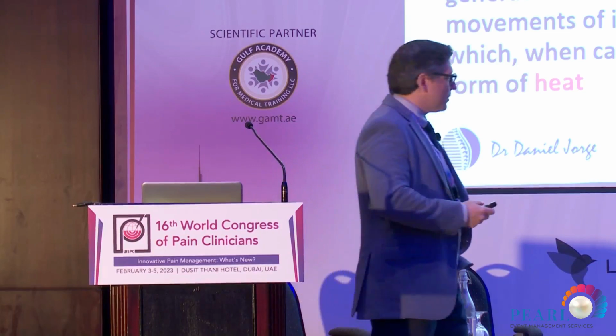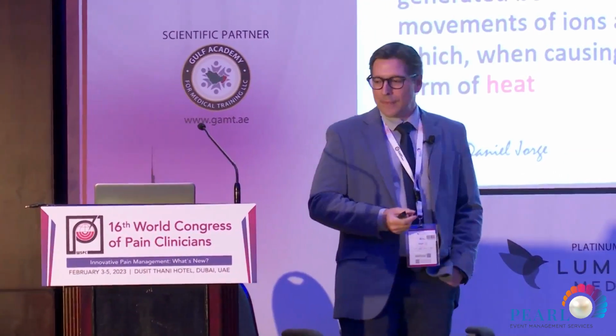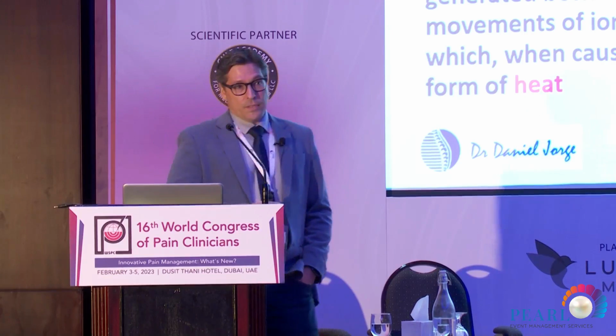First of all, I'll start with some basic knowledge about radio frequency, just to make sense of everything we're going to discuss later. We know the radio frequency is a generator connected by two electrodes, the active one and the dispersive, the earth plate. The active one is all isolated except for its tip, where we have the temperature sensor. And we can choose different sizes of active tip, 5, 10, 15, 20, depending on the target, on the kind of treatment you're going to choose to do.